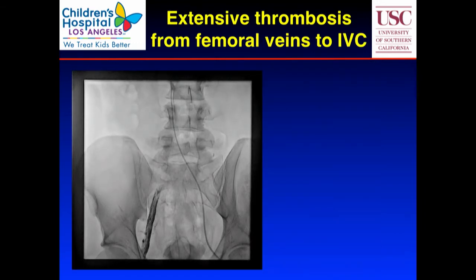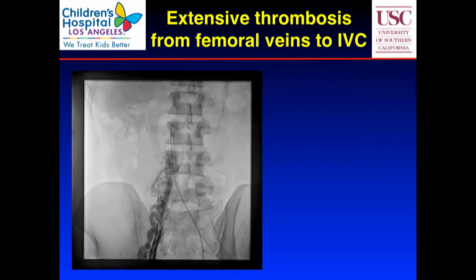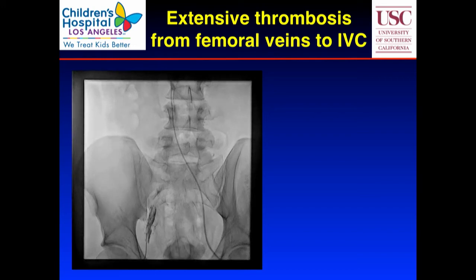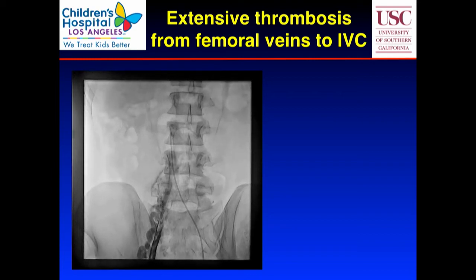So here's the patient now. You see how the blood has nowhere to go. In fact, you see some little clots sitting inside that vessel. These are old clots, thrombosed down, and blood just can't make its way. So the body can't get the blood out adequately, and guess what? The leg swells. In fact, he noticed that this happened as he was going through his puberty growth.